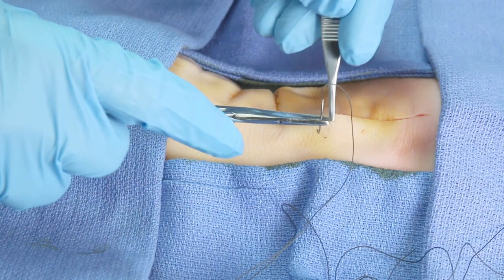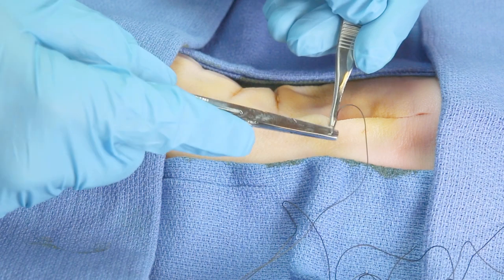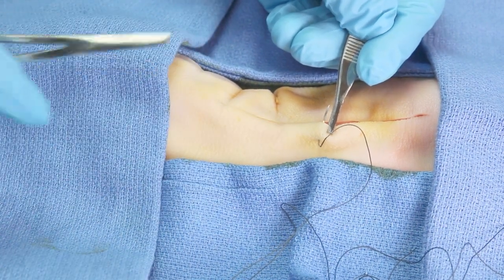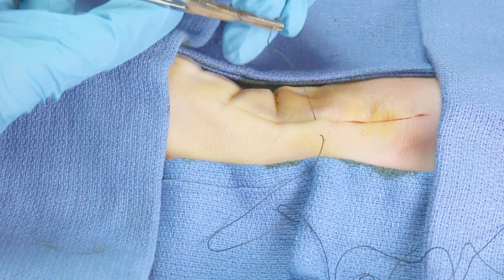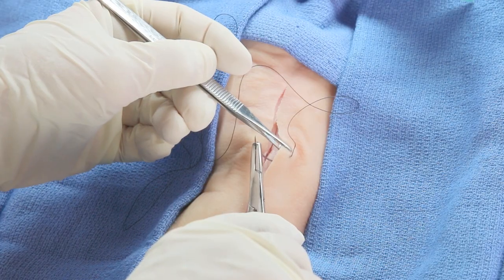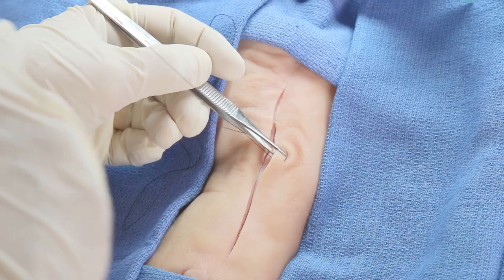But we're doing a simple skin closure today. Go through the skin on one side, holding it with the Adson forceps in such a fashion that your hand doesn't obscure your view of the needle. Then grasp the needle with the needle holder and reload. Notice that I always have the Adson forceps holding the skin when a needle is in the patient — this prevents the needle from moving around and getting lost in subcutaneous tissue.